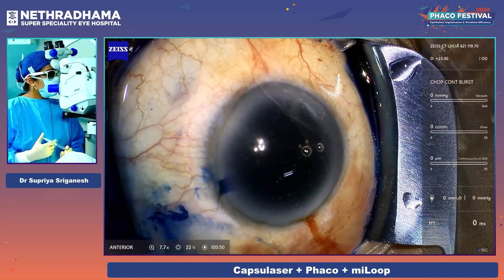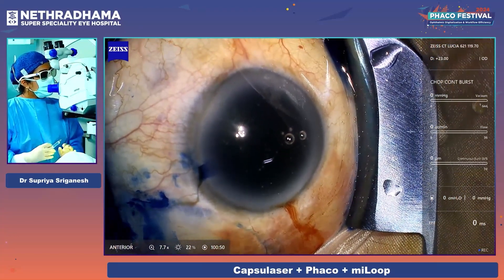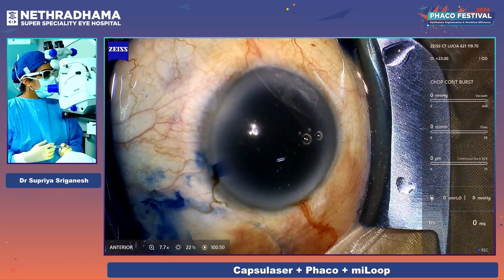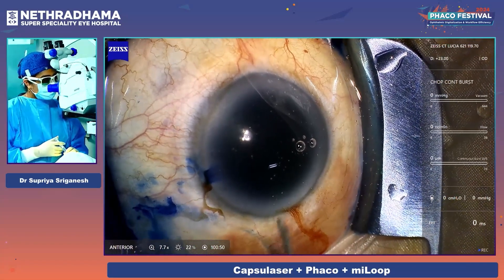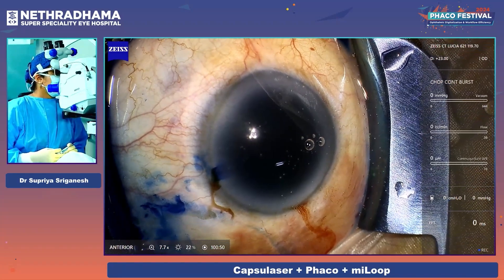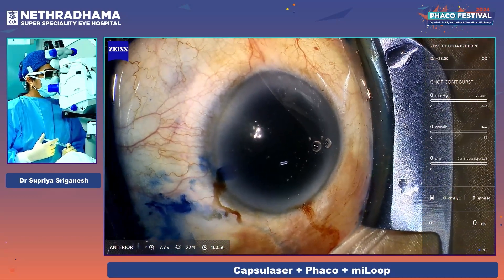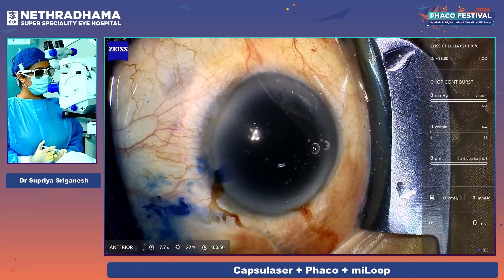The 60 seconds is very important. Once the staining is adequate and even all over the capsule, you get a nice free-floating anterior capsulorhexis. For this case, I'll be using the Zeiss CT Lucia lens 621P of plus 23 diopters.